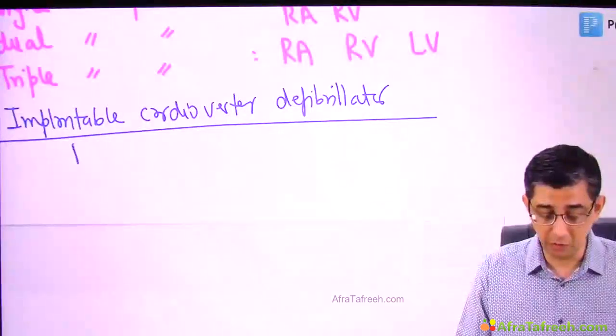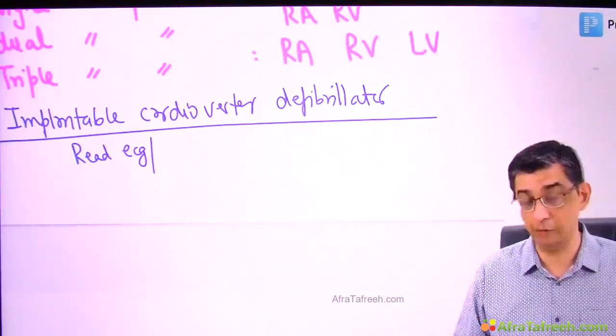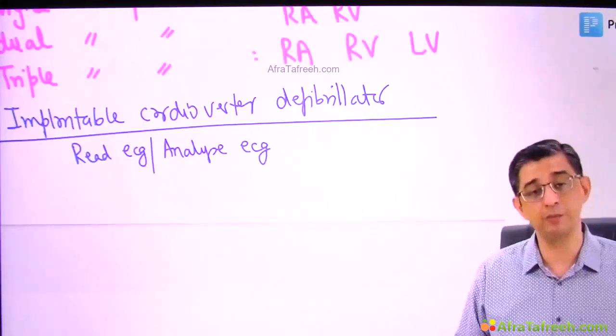But first, I want to teach you what ICD as a device will do. It will read ECG better than any of us, because this is a sophisticated computerized algorithm. It will analyze ECG.